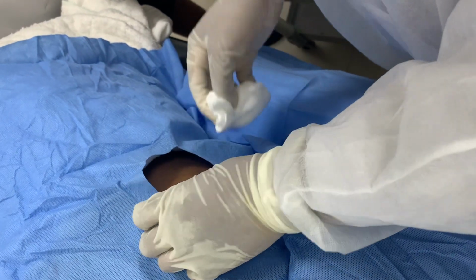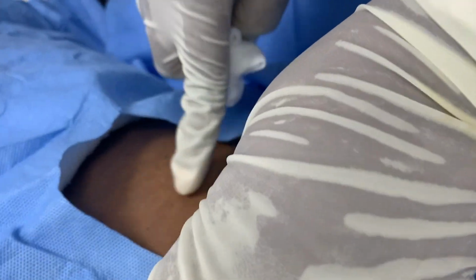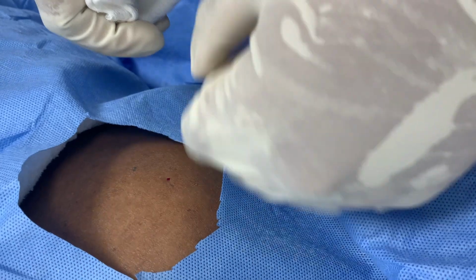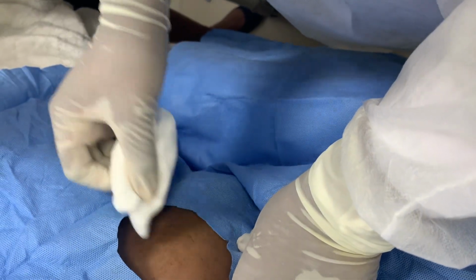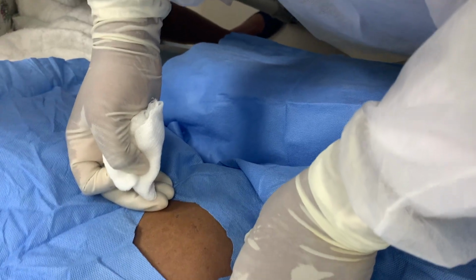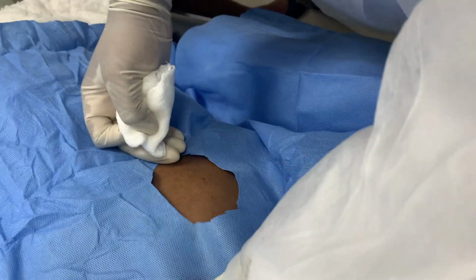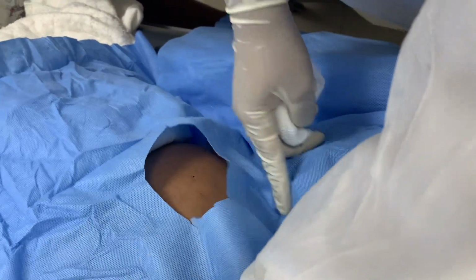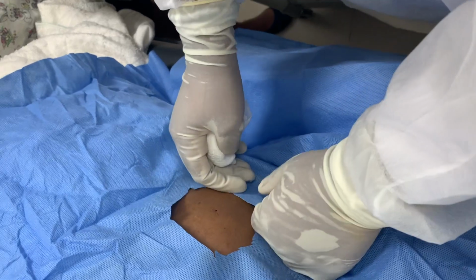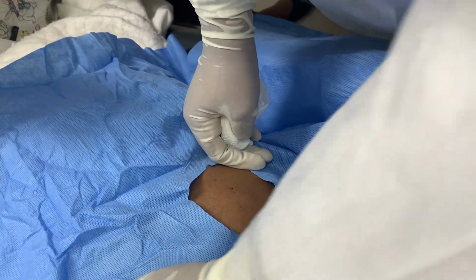So basically, I sterilized the area using betadine and then alcohol, and then I put over the drape. After injecting the lidocaine and waiting for a couple of minutes, I did a pinch test to be sure that my patient is not feeling pain in the area that I had anesthetized. So after doing the pinch test, I could now go on with my procedure.